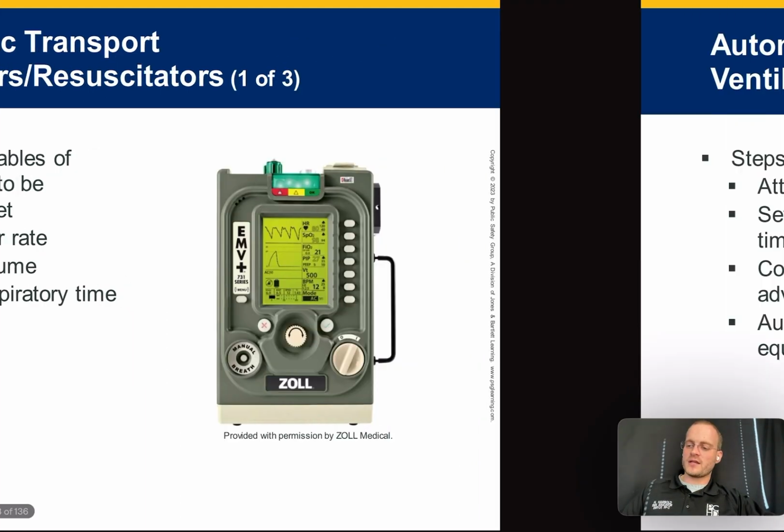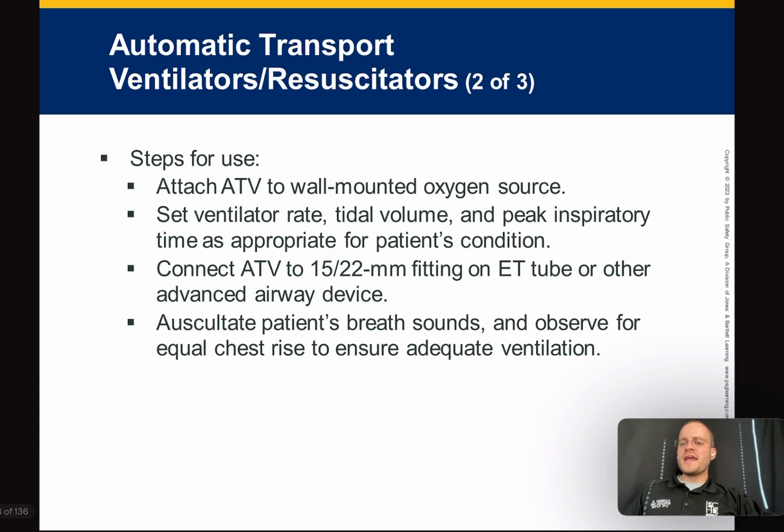It's complicated, and I'm actually not going to go much further into this because EMTs don't use these very often. I just want you to be aware that there are machines that will do all of it for you. Okay? They're expensive. They're paramedic toys. And they're very complicated to operate and they can cause harm very quickly to patients if you don't know how to use them. Okay? So just be aware of that.